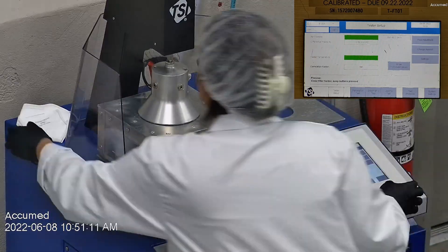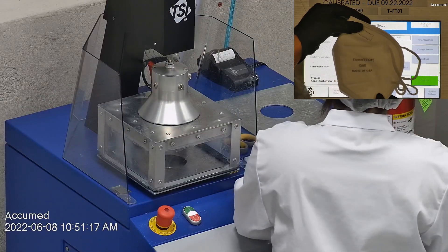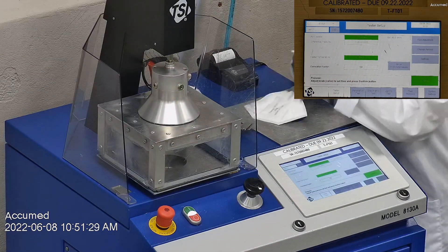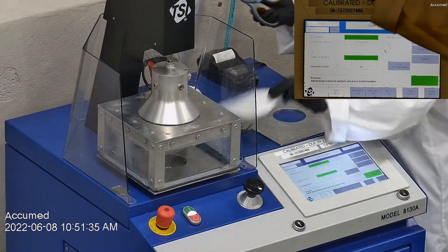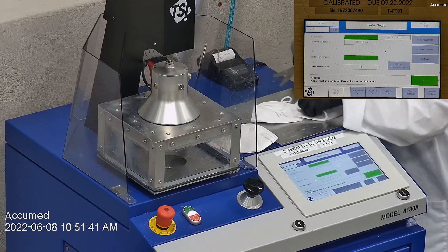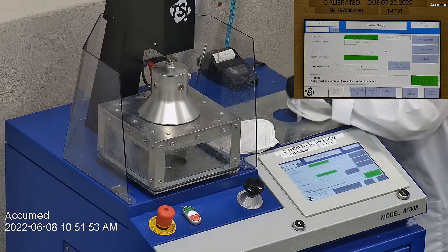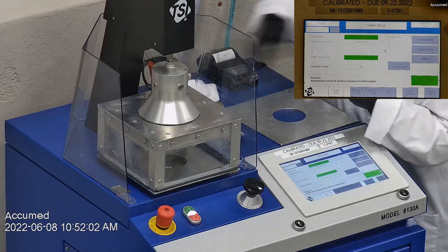With that being said, we're going to see how these test on our TSI machine. We're going to be testing both the filtration efficiency and the pressure drop. This is our TSI machine model 8130A, which is also the same testing machine that NIOSH uses to approve N95 respirators. Our procedure is inspired by NIOSH — we first run a tester setup and start by removing the headband from the respirator before placing it onto a testing plate to ensure a proper seal.